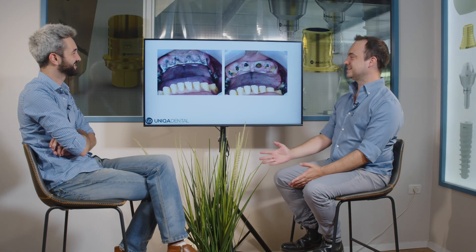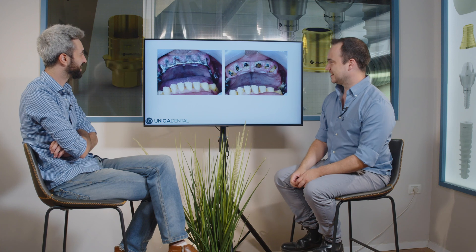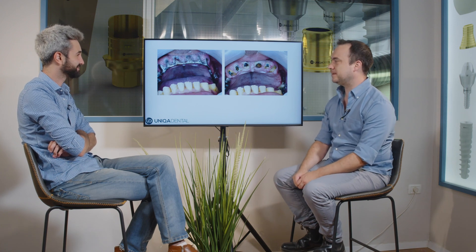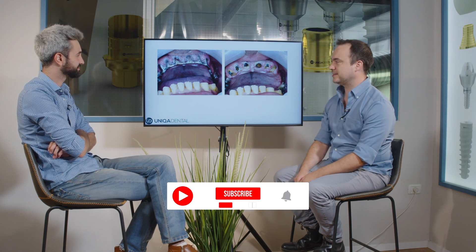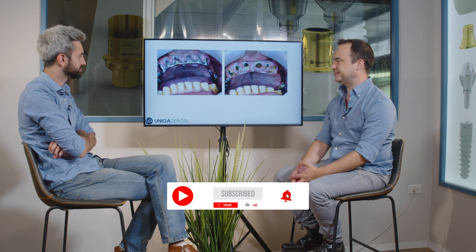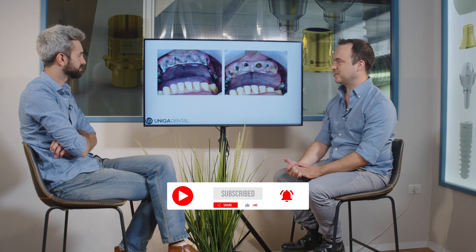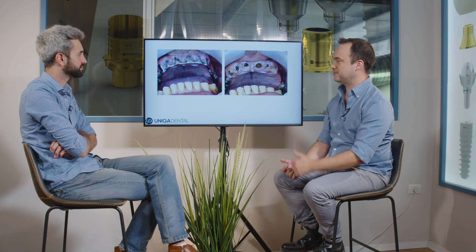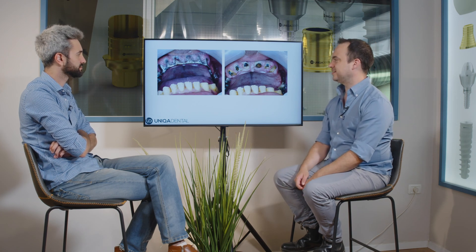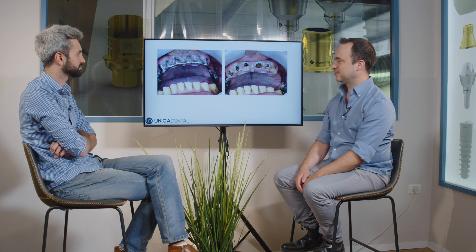What do we have here today? Extractions. A bar. We have a telescopic bar on teeth and a secondary bar on this telescopic bar, and probably all of the teeth on this bar are lost.